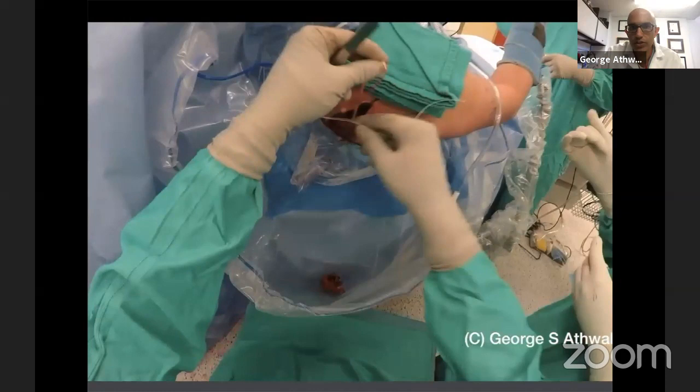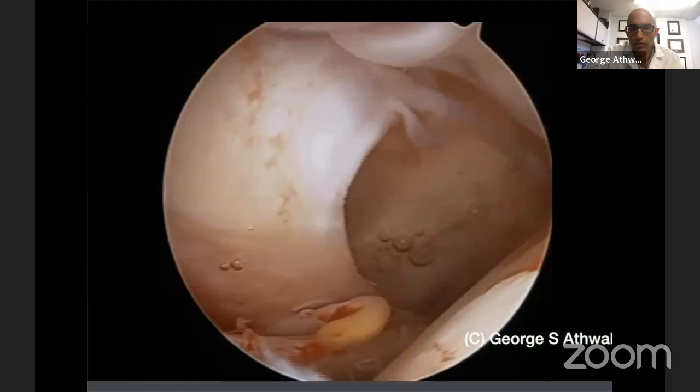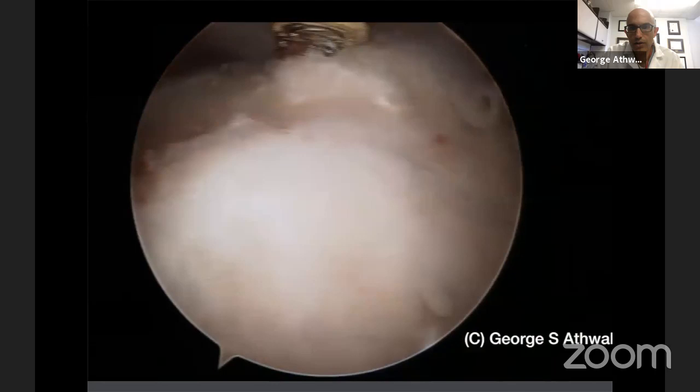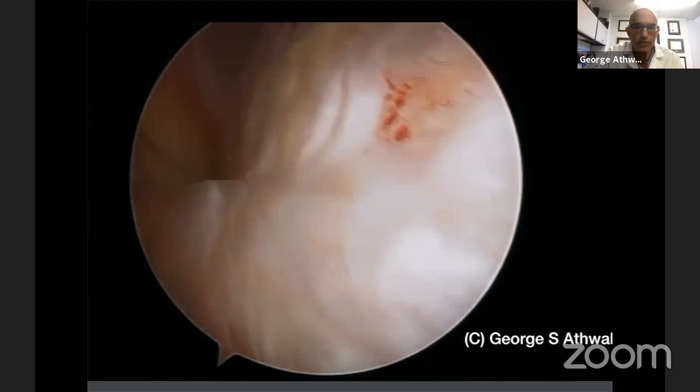Now we're going to go inside the shoulder joint, with a posterior viewing portal. Remember from the MRI, massive rotator cuff tear. This right there is the teres minor. You can see a good view of the teres minor insertion posteriorly. Now I'm going to go ahead and do my standard debridement. There's the teres minor again, viewing from posterior lateral.